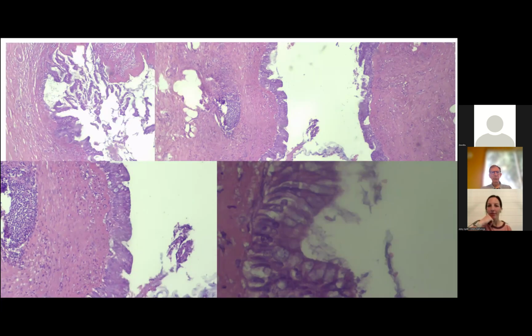The lymphoid follicles are atrophied, the muscle proper is effaced, and the mucosa is lined by this tall columnar mucinous epithelium with areas of acellular mucin accumulation. We took a serial section and we couldn't find a destructive stromal invasion, both in the muscularis propria and also in the serosa, just acellular mucin only. Next slide.